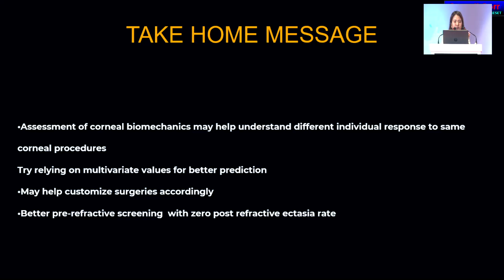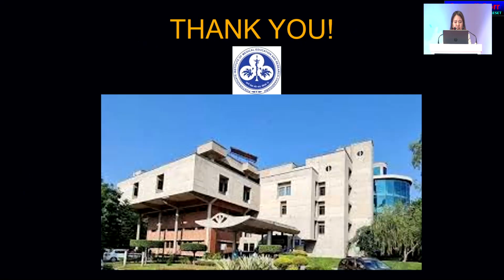So to conclude, I would like to say that assessment of the corneal biomechanics may help us in understanding the patient and give more of an individual based approach for corneal procedures, and we must rely on multivariate analysis or values rather than the univariate values. It can also help us in customizing the surgeries to each and every patient in a better way, and also to detect post refractive surgery ectasia at an early stage. Thank you very much.